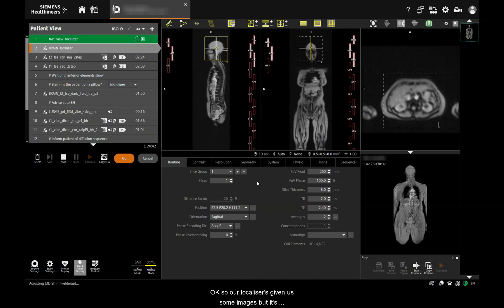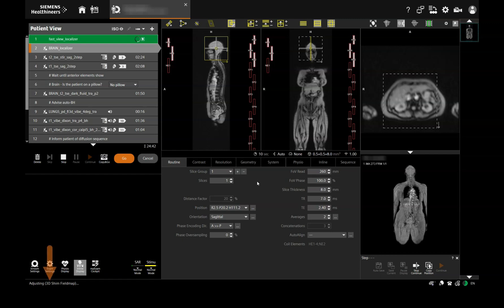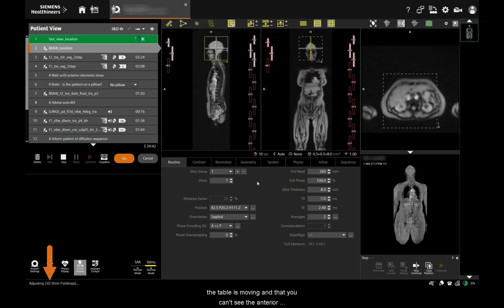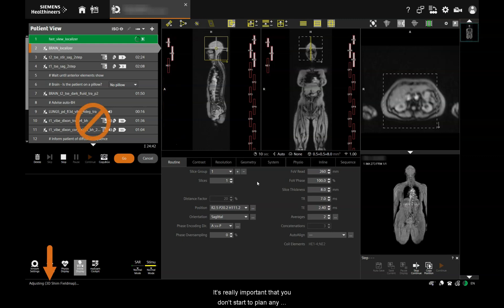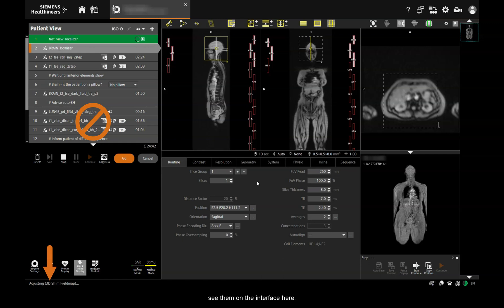Our localiser has given us some images, but it's important to note that it hasn't finished its task yet. Notice that the scanner is still performing adjustments while the table is moving, and that you can't see the anterior elements of your body 18 coils. These elements will only display when the adjustments have all completed. It's really important that you don't start to plan any sequences that require those body 18 coils before you can see them on the interface. Auto coil select won't know to pick up the relevant elements, and as a result you'll end up with very noisy images.